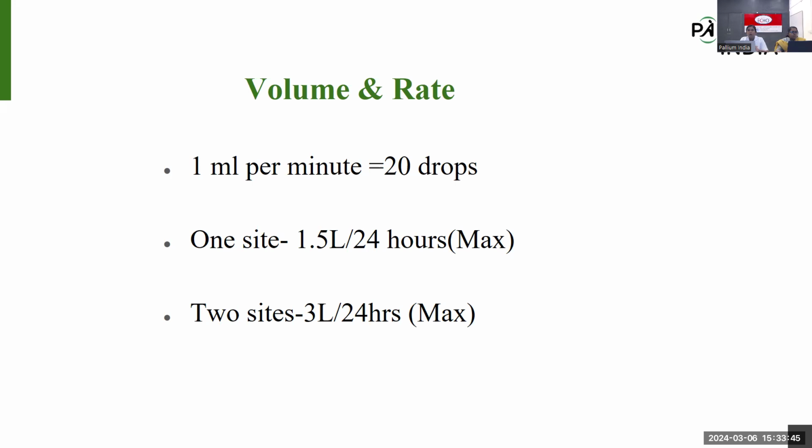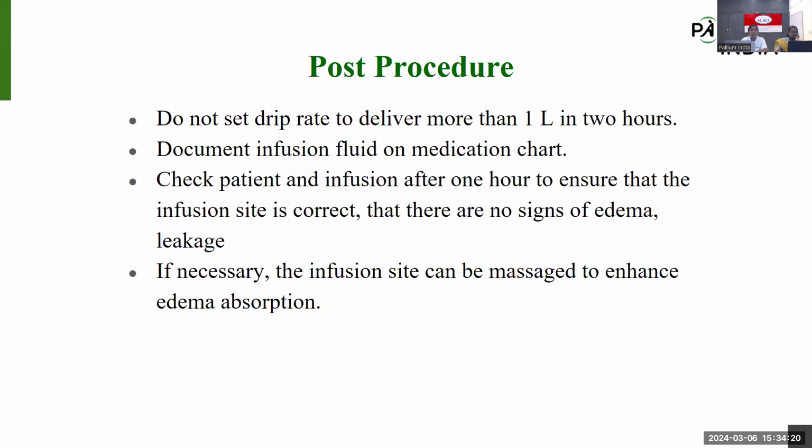And if the patient is having moderate rehydration, we can choose 2 sites at a time. But there is a fluid limitation for the administration. In one site, we can administer a maximum of 1.5 liters over 24 hours. This is the maximum administration rate. And if we are choosing 2 sites, within 24 hours we can administer up to 3 liters. This is about the volume and rate.